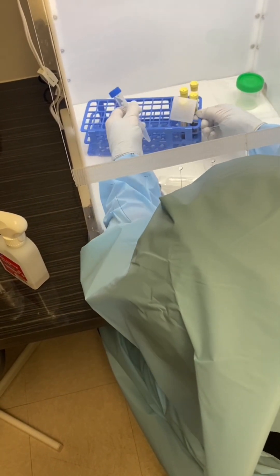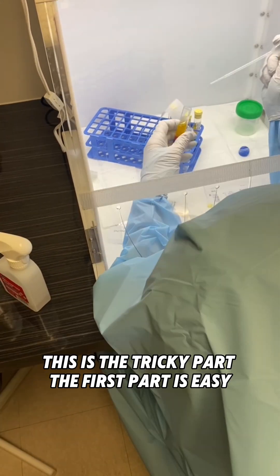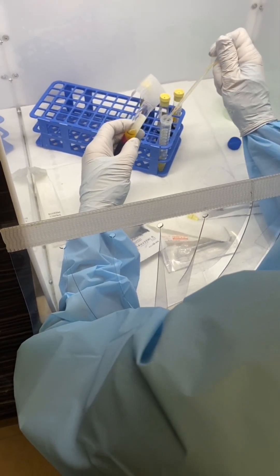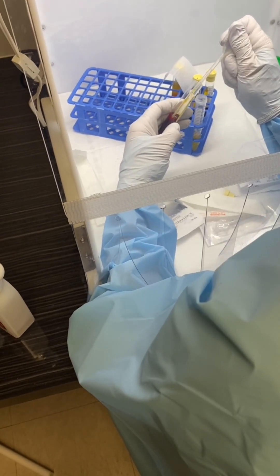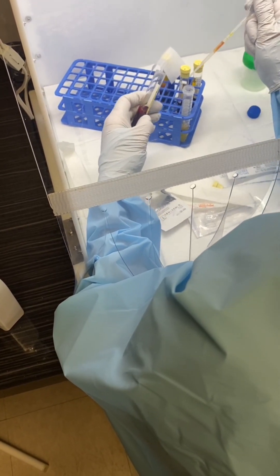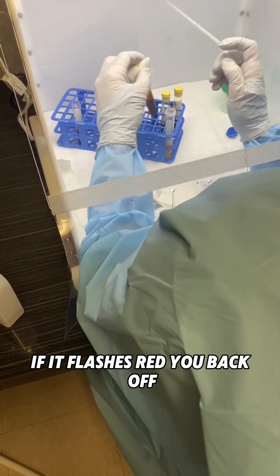I grab my pipette — this is the tricky part; the first part's easy. You can see I'm getting some red blood cells, so I back off. If it flashes red, you back off.